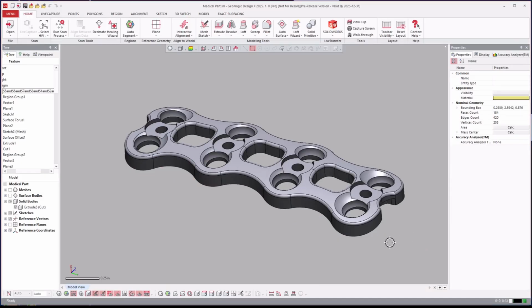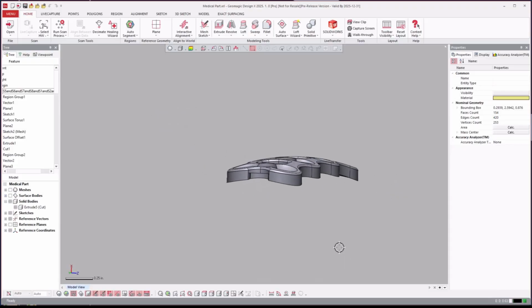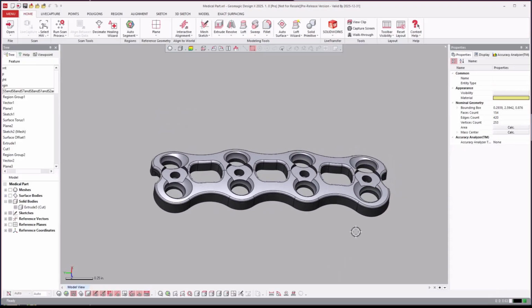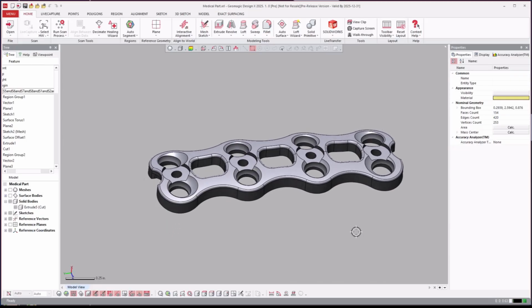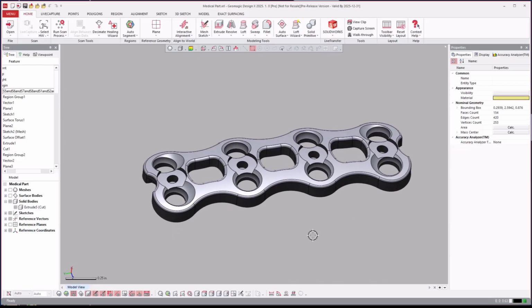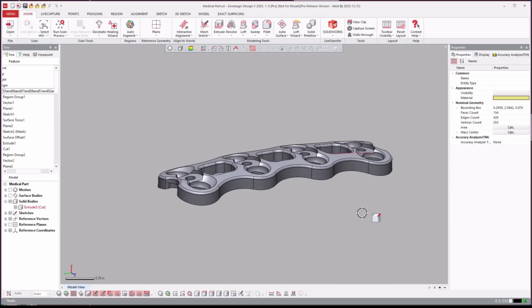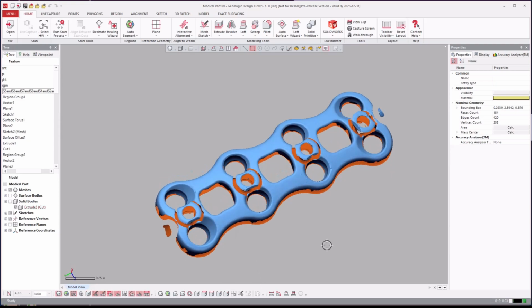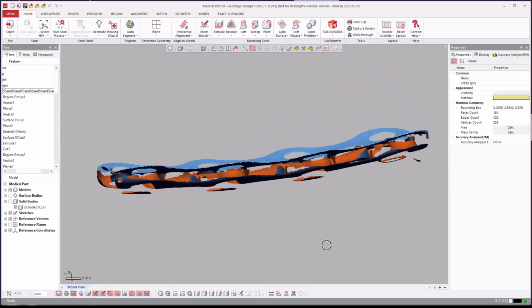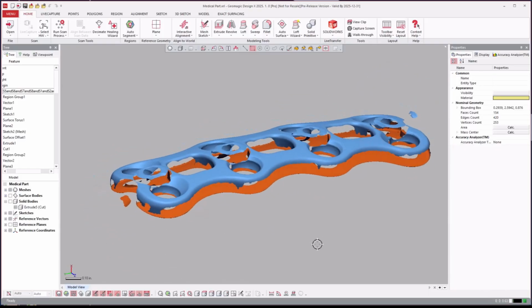So here we have the medical part that we talked about. And for those of you that don't know what this is, it's a brace that you would screw into bones, right, and screw them back together. So this is made to fit a custom shape here. And here's the scan. And we'll turn off the solid there. This is the scan that they've captured it with. And we'll rotate it around.